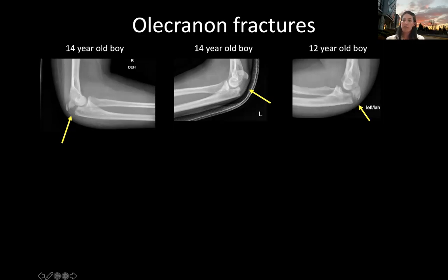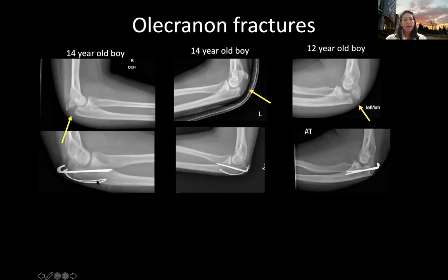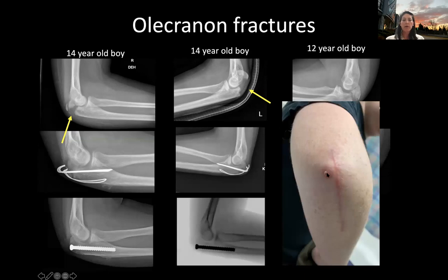And then this one is a very similar fracture in a 12-year-old boy. We tend to use what we call a tension band construct to repair these two fracture fragments together, with wires inserted and a band that holds everything together. In this x-ray on the right, instead of using a wire tension band, we used a suture tension band, which doesn't show up on the x-rays. The reason for those tweaks is that this hardware does tend to be prominent. Oftentimes, as in this young man, where you can see there's not a lot of padding on the back of the elbow, if this hardware is causing issues, we will usually remove it and replace it with an intramedullary screw, which is less prominent but avoids the fracture from happening again.